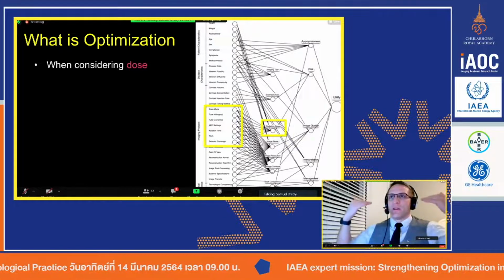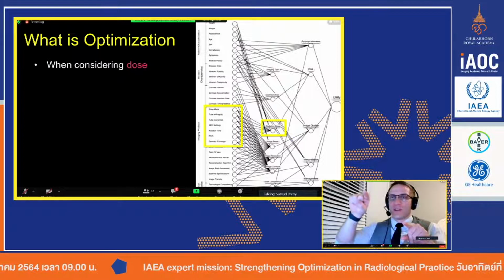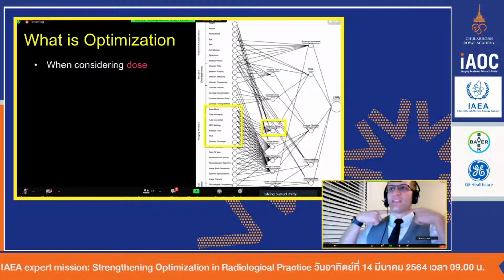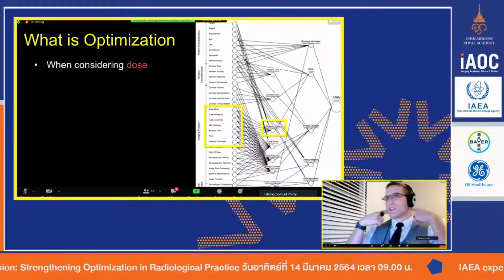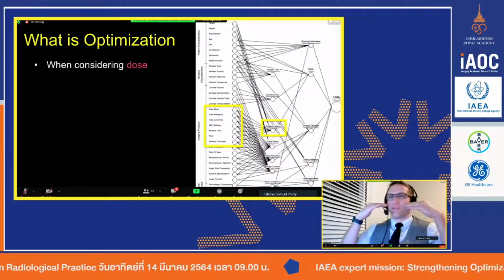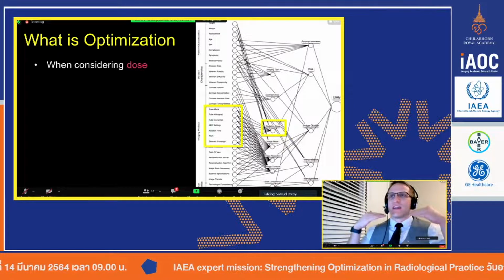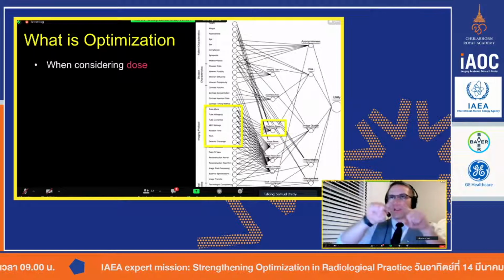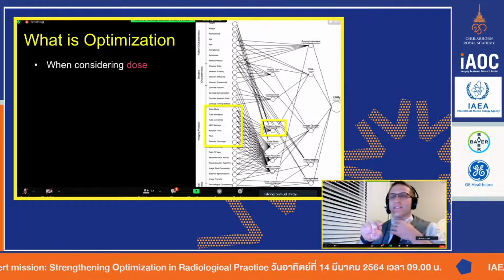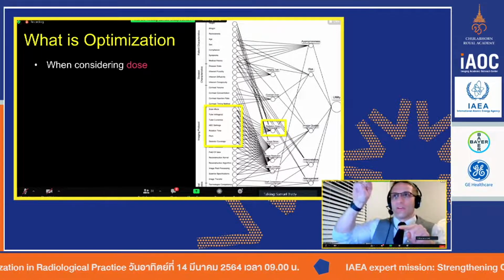bottom up. And the reason behind that is I mentioned that when your system is trying to ramp up radiation, you obviously need a lot of radiation to get through your shoulders compared to your neck and even the jaw to get up to C1, C2. And so when you start imaging right here, you don't need a lot of radiation. So you'll start with a moderate amount, but then as you start scanning down, once you get into the neck, if you look at the dose profile, it's going to go up and then it's actually going to go down. There's not a lot of tissue here. And then when it goes from this neck to these shoulders, it needs to go up really quick.